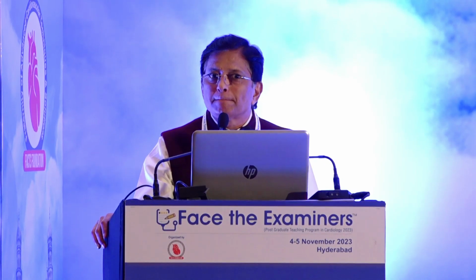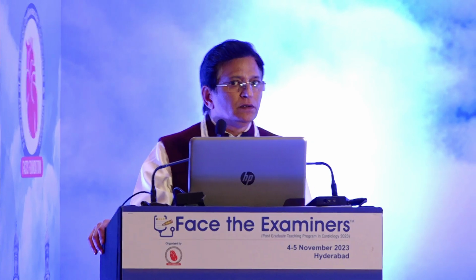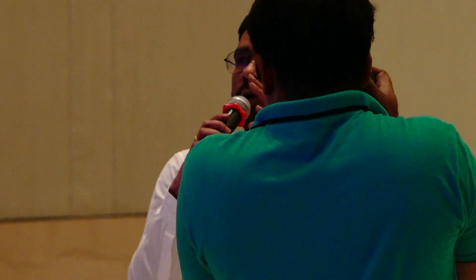Hello, sir. In the last case, the problem was we were not able to identify the site of deployment. You said he stabilized the table, not moved. In that case, we can take other access and a pigtail catheter to take a shot. Sir, in the last case, via guide wire we passed the stent. So the problem was to identify where to deploy the stent.